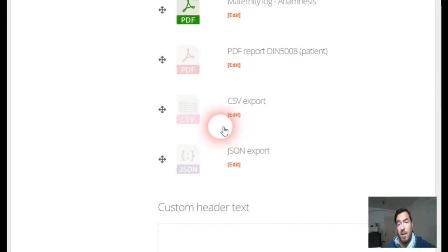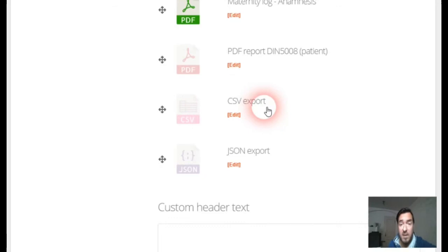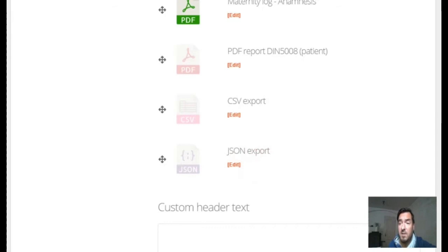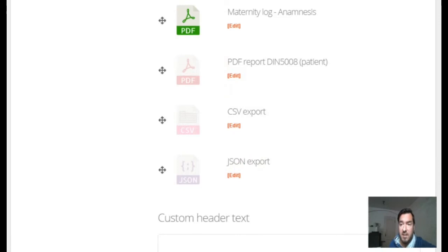Then we have other reports which are deactivated here, but in your account you can always activate them as needed. They are not used very often, which is why they are generally deactivated. CSV export and JSON export are special formats — you can export your examinations in these data formats as well.